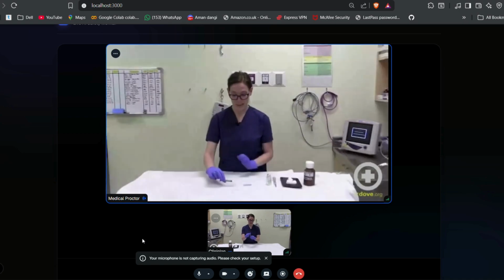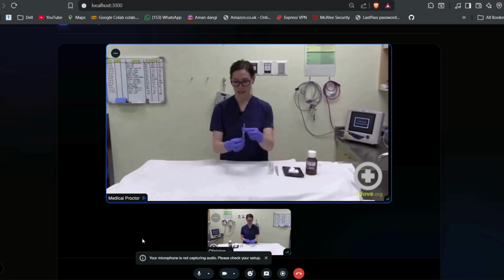I can see the medication vial now. Please state the medication name and expiration date.